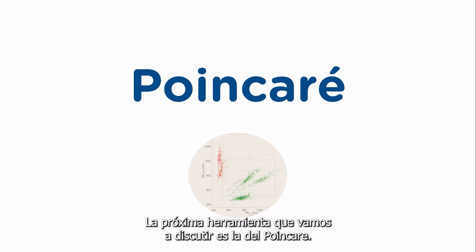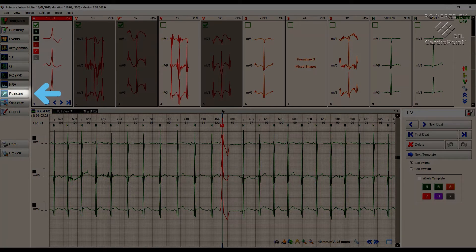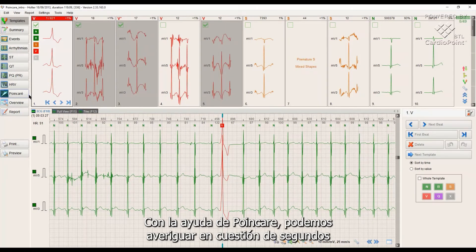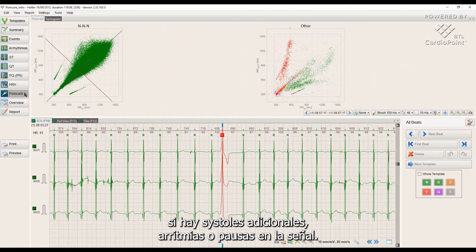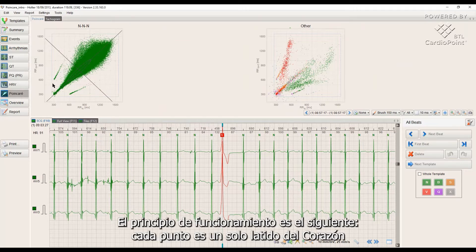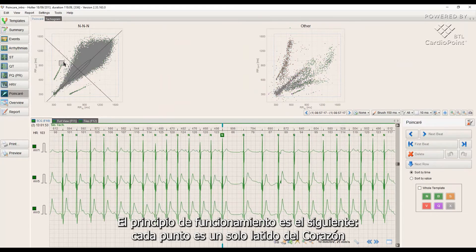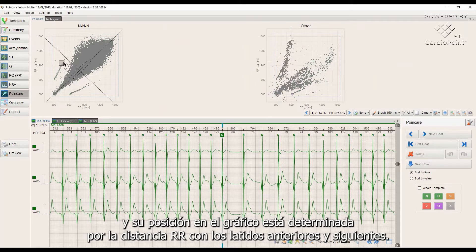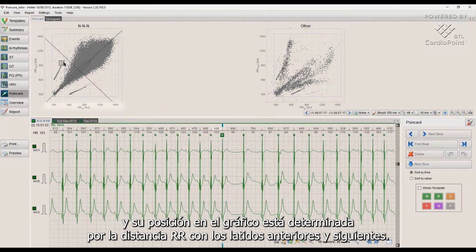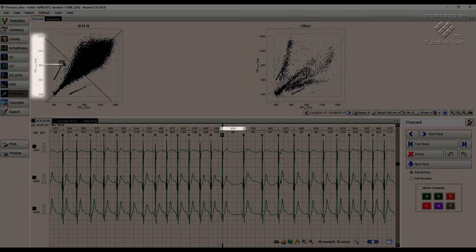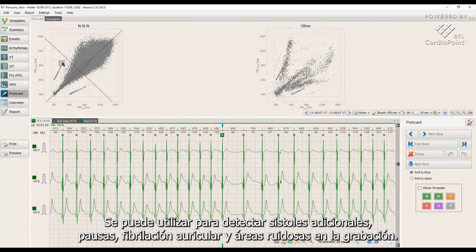The next tool we will discuss is Poincare. With the help of Poincare, we can find out in a matter of seconds whether there are extrasystoles, arrhythmias, or pauses in the signal. Each point is a single heartbeat and its position on the graph is determined by the R-R distance with the preceding and following heartbeats. It can be used to detect extrasystoles, pauses, atrial fibrillation, and noisy areas in the recording.